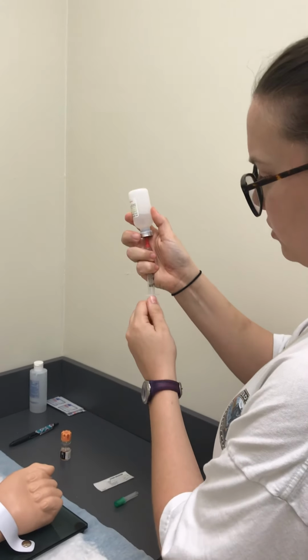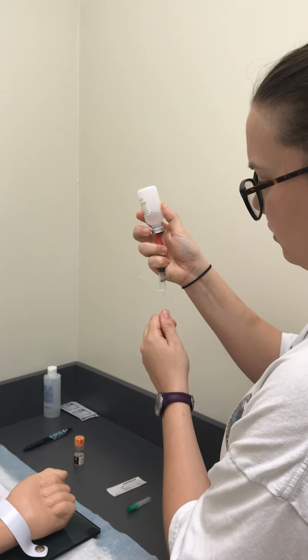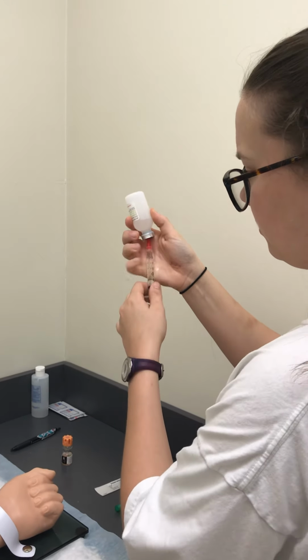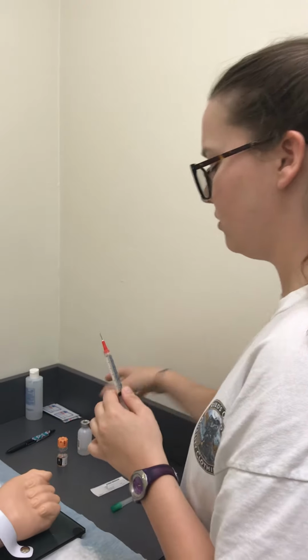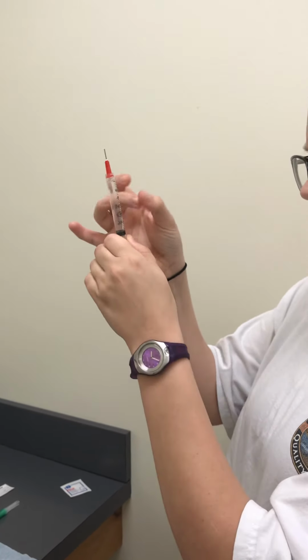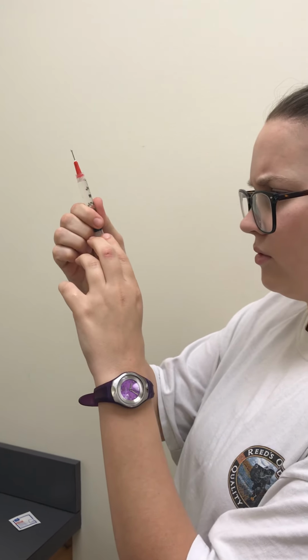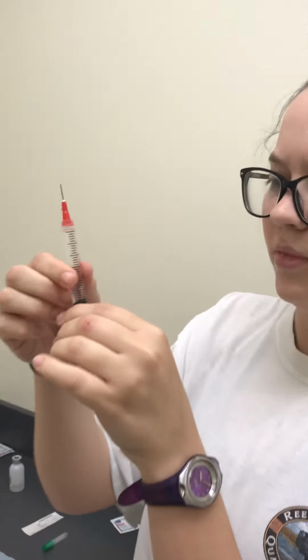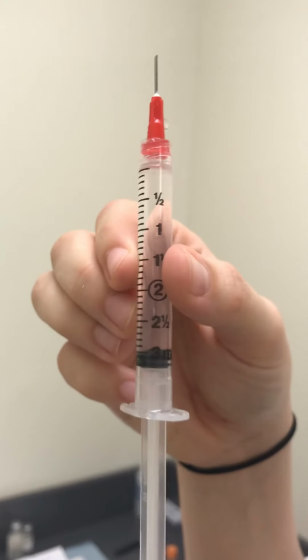We're going to pull back to 3. Okay, I have 3 milliliters in the syringe.